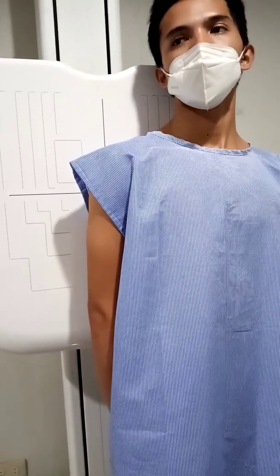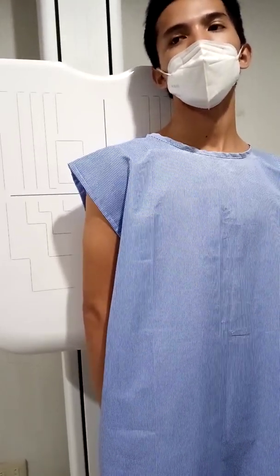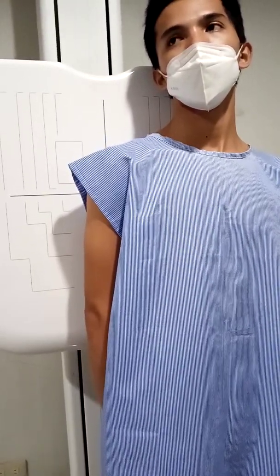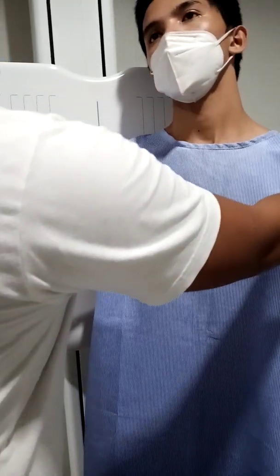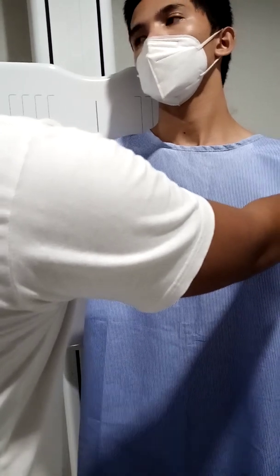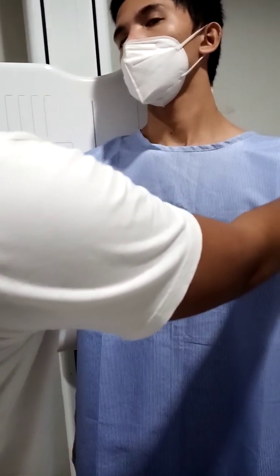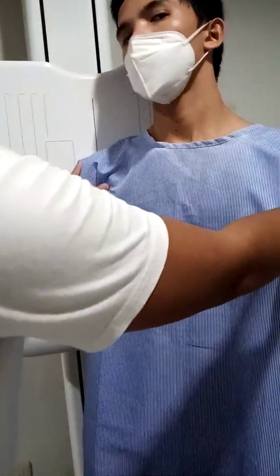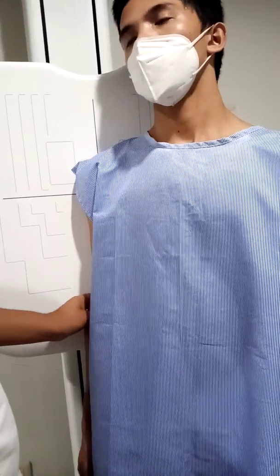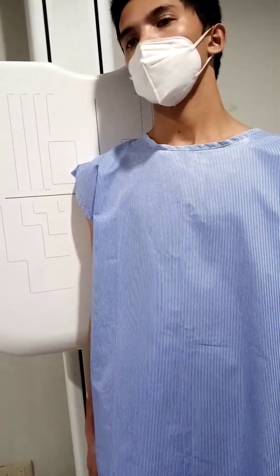Then, make sure that the body of the scapula is parallel with the IR. Hand and arm in neutral rotation. So, position the patient 35 to 45 degrees. Center his shoulder at the IR. Today we're going to demonstrate a 35 degrees angle for the Grashey's method.